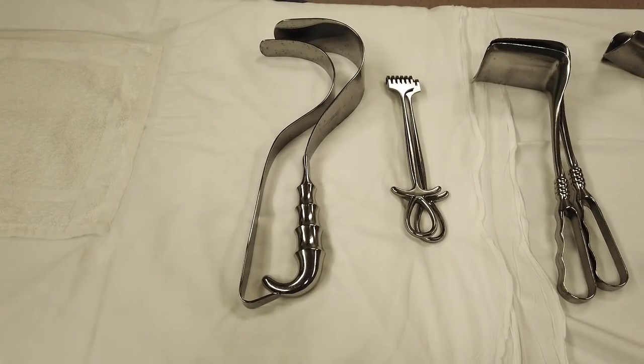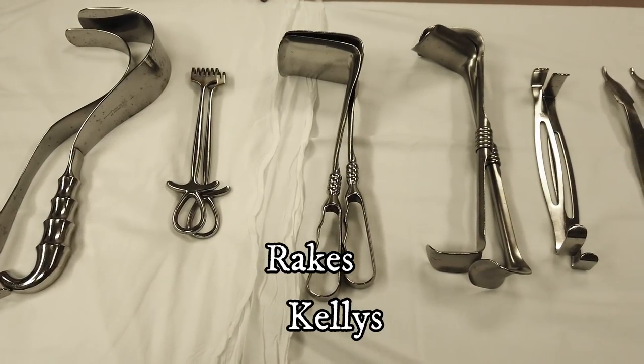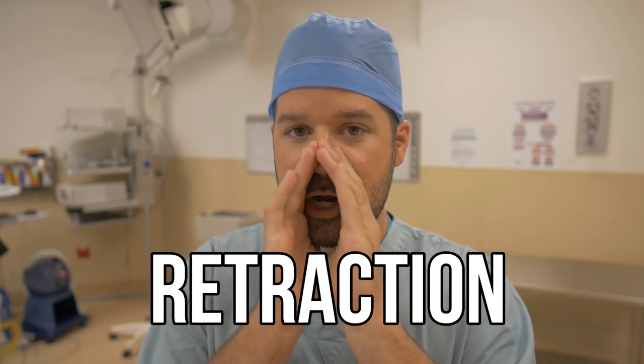There are a ton of retractors out there that we could use, but today I'm just going to show you a couple common retractors that you might see in the OR. Going down the line here from left to right, we've got some Deavers, some Rake retractors, some Kellys, Richardsons, Army Navies, and the good old Ortho Hohmann retractors. They're pretty common retractors that you might see in a multitude of different specialties and surgeries, but they all have the same purpose: retraction. It's important to know how to hold a retractor so you don't get fatigued super fast as an assistant.